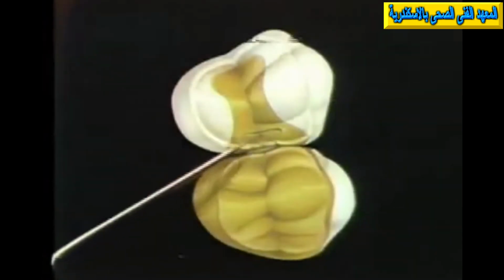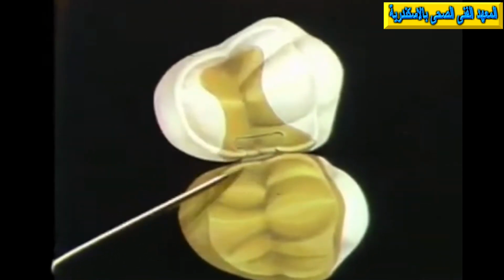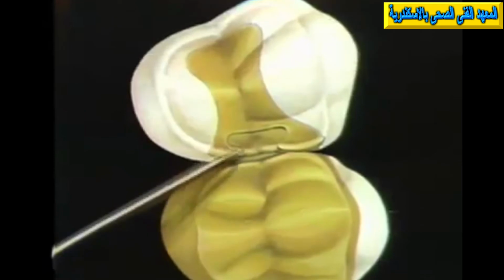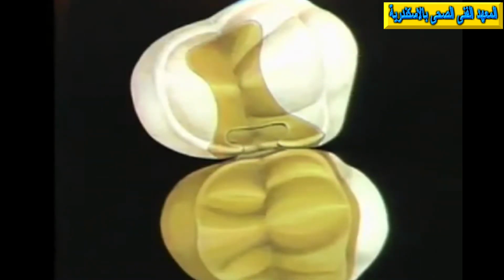If we can just go back to the previous illustration, we can emphasize once again the occlusal morphology of the key itself, the development of the normal marginal ridge on that tooth and on this one, and the occlusal embrasure left in between. It's most important to restore this morphology in making the key and the keyway.